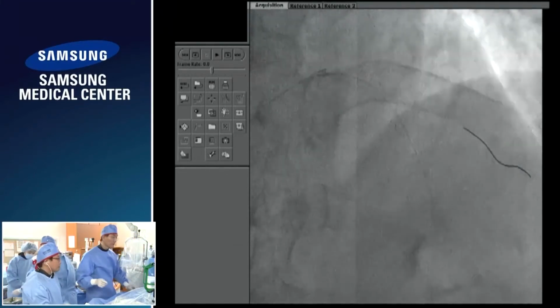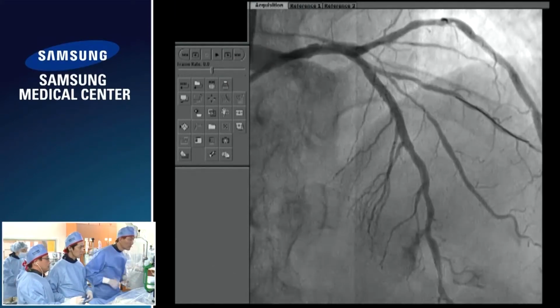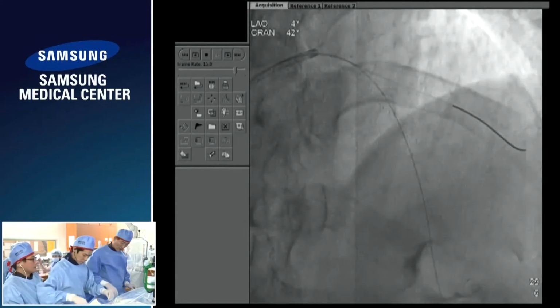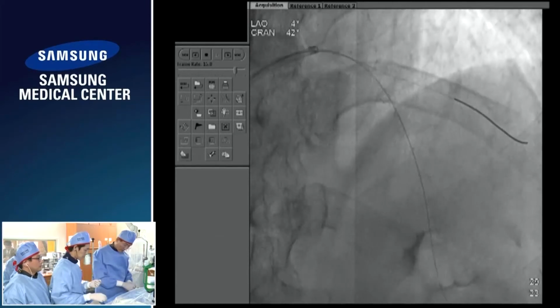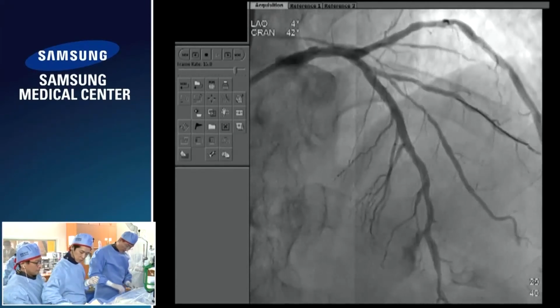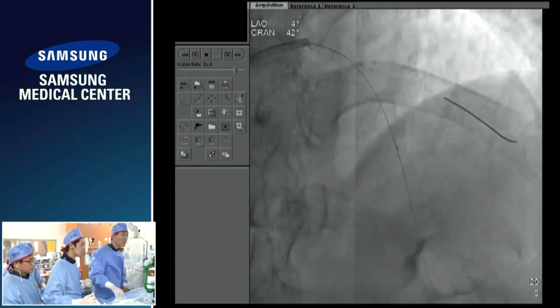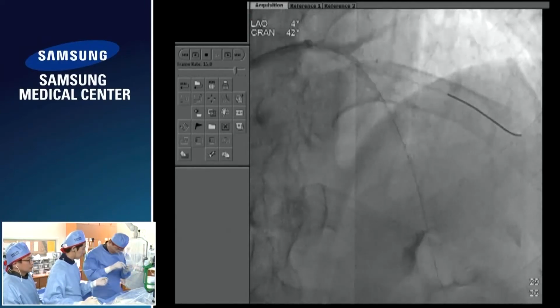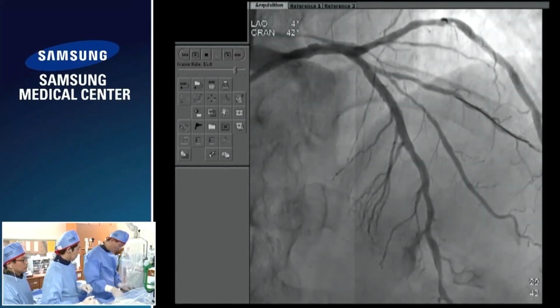Angio. Okay, it looks okay. The filling defect has gone away after side ballooning. It looks really nice. So, yeah, I'm not sure, but definitely I think there is some deformation in the main vessel LAD BVS. I think it should be corrected afterwards.